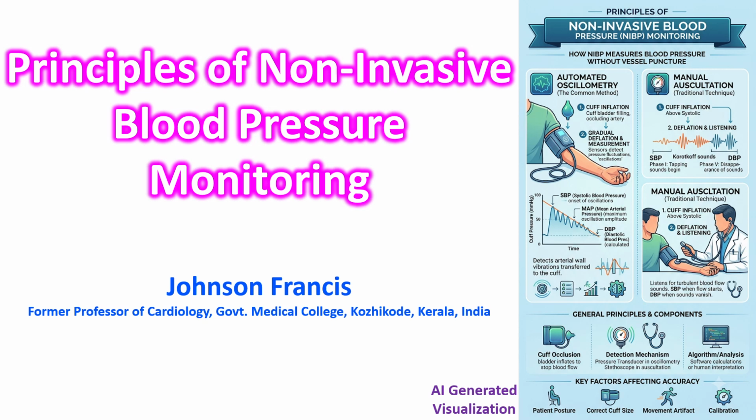While invasive arterial cannulation remains the clinical gold standard in acute care settings, non-invasive blood pressure, that is NIBP, monitoring relies on applying external counter pressure to assess arterial wall dynamics. The underlying physics and signal processing vary significantly depending on the technique used.